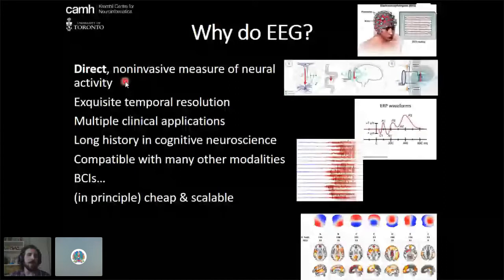The key thing that is generally highlighted as an advantage of EEG is temporal resolution. You're really measuring neural activity on the time scale of neural activity, on the order of milliseconds to tens of milliseconds. When you think about the characteristic timescale at which neurons function, it's on the order of milliseconds, in terms of generating action potentials and having a neuronal response to an input.